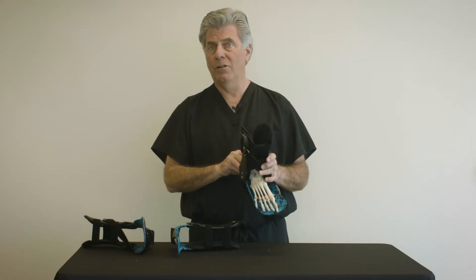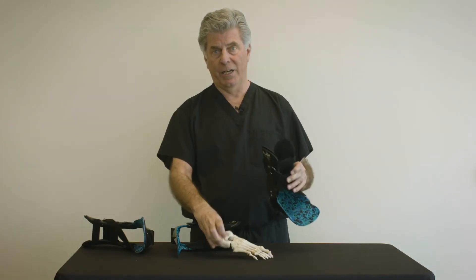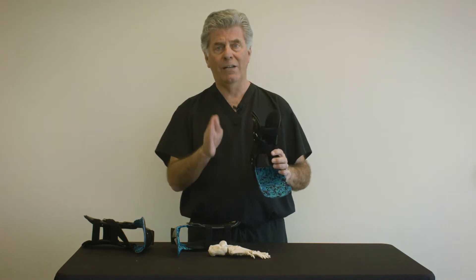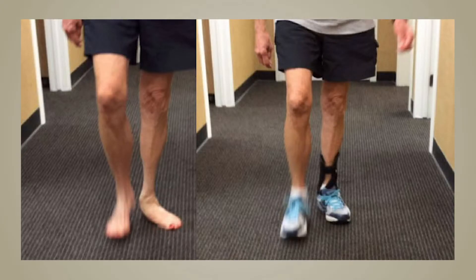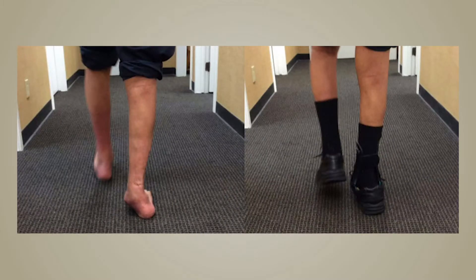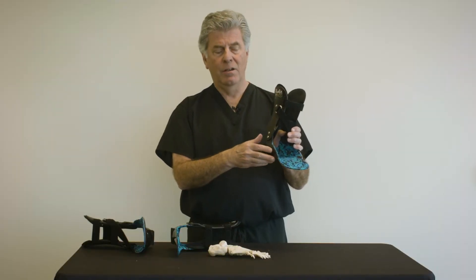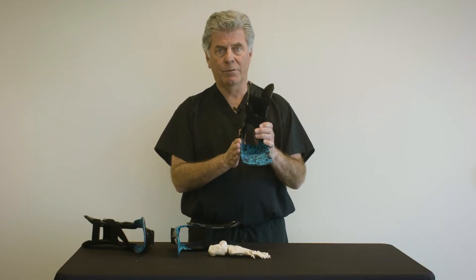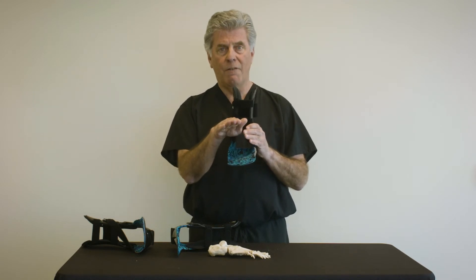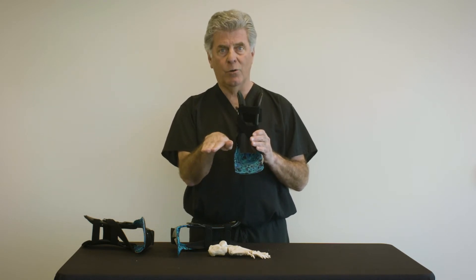To determine when to order the lateral flange ahead of time, it is important for the practitioner to watch the patient walk and look for any degree of forefoot abduction during the stance phase of gait. When in doubt, order the lateral flange. It can always be removed later with simple grinding in the office, but in most cases it's comfortable and provides an important control of the forefoot in adult acquired flat foot.